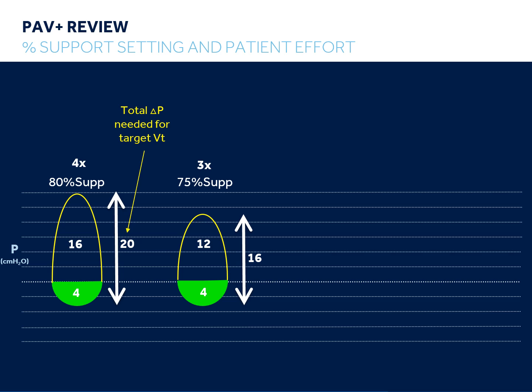This lower overall pressure gradient would cause a smaller tidal volume to be delivered, which should cause the patient's respiratory center to increase their effort in order to continue to get the tidal volume the respiratory center desires. In this case, with a patient effort of 5 centimeters of water, the support delivered would be 15 above PEEP, and the total pressure gradient is back to the 20 centimeters of water necessary for this patient's respiratory center to get the tidal volume it desires.